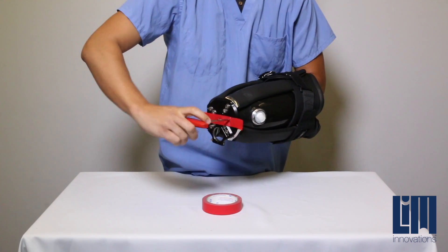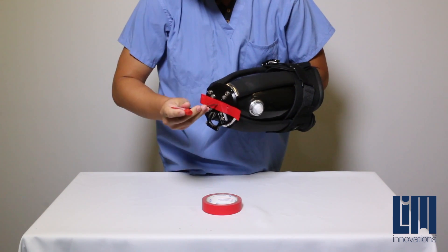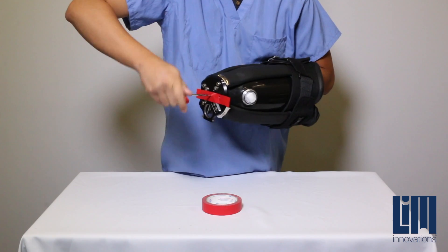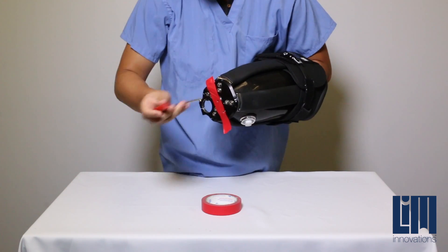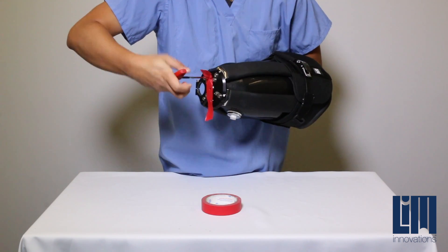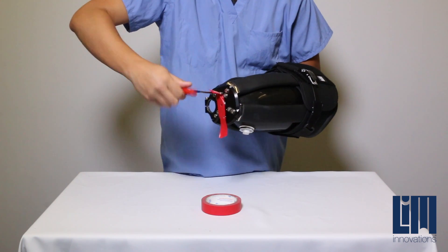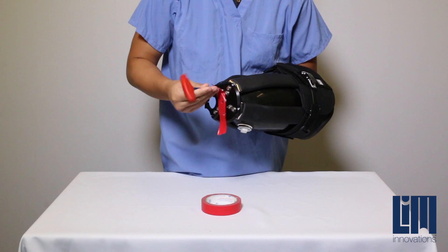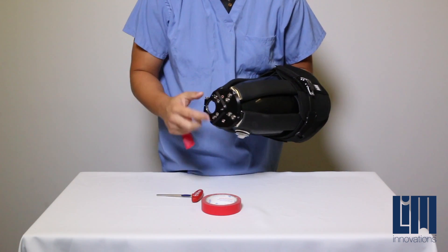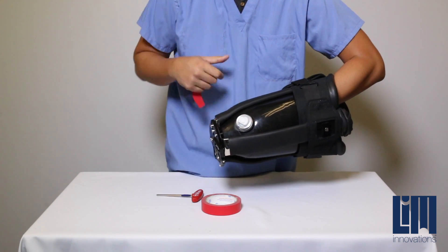Each of these three screws do not need to be overfastened — they only need to be finger tight. Once resistance has been met at each of these screws and the cup is securely tightened, installation is complete.